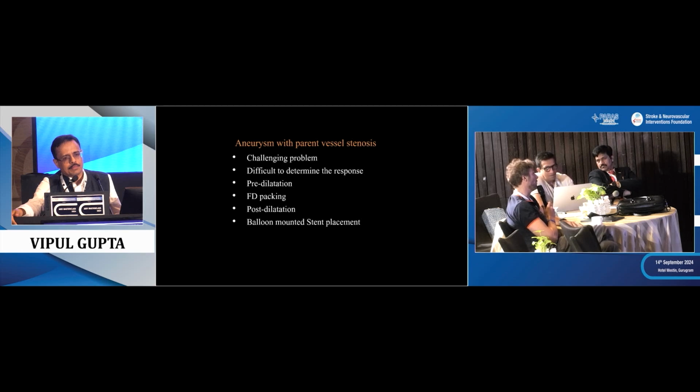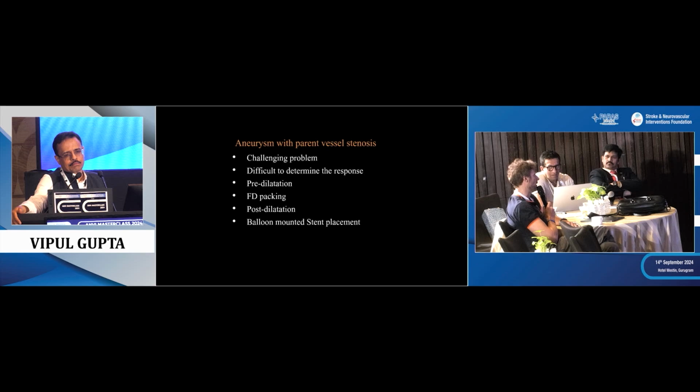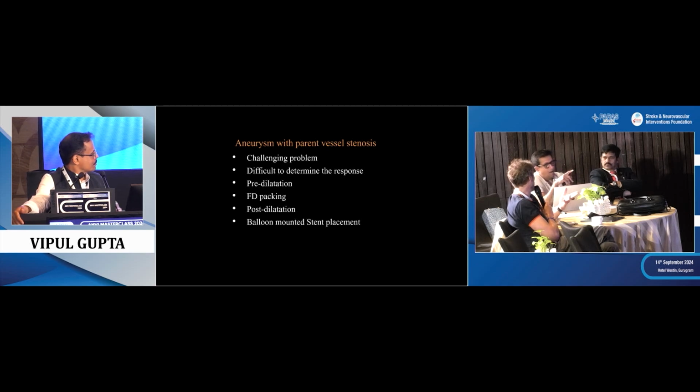And if you have some manipulation to do for any reason in the stent to open it, I would say, okay, you put a coronary stent. You prevent the reperfusion syndrome by keeping the pressure low for 3 weeks or 1 month. Then you wait for reendothelialization and then you go for flow diversion. Maybe it would be like that, because it's not an easy procedure.